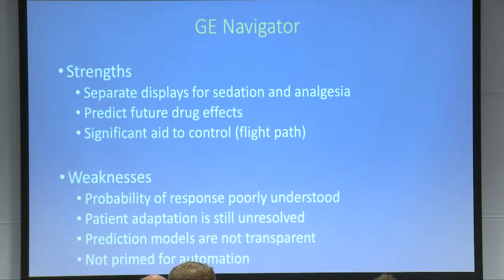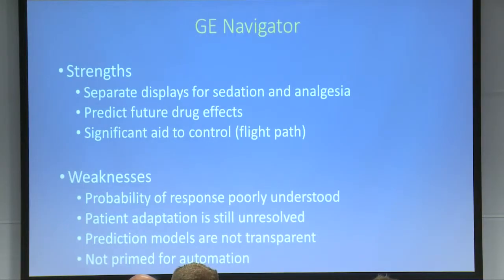We use different drugs to control both. So it's important to have both displayed so that you can manage them. And I'll show later in some of the results that it's made a difference in how analgesia is managed during the case because of the separate display of sedation and analgesia rather than adequate and light anesthesia.